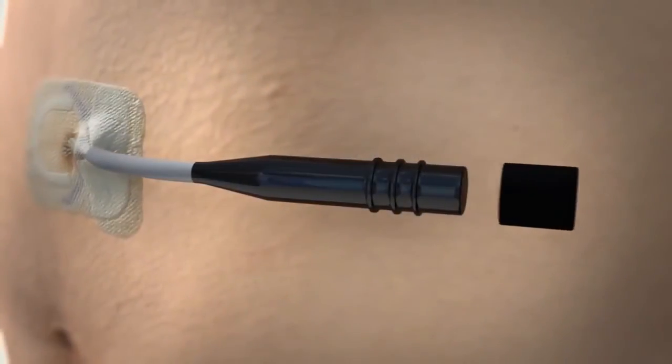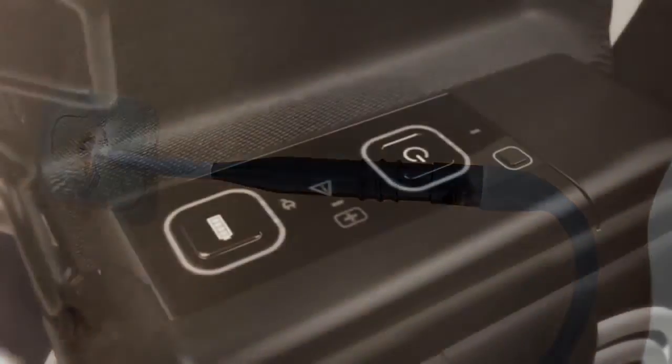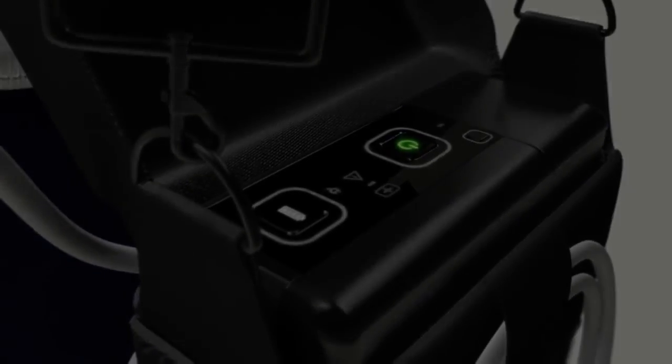While disconnected, they may notice some return of shortness of breath. When they are ready to reconnect, the cap is removed, the percutaneous interface lead is attached to the drive lead, and the power button is pressed. The device will automatically re-synchronize to the patient's heartbeat and resume therapy.